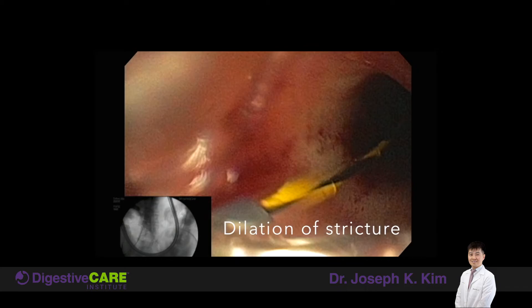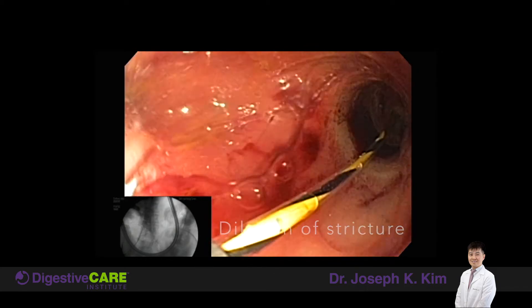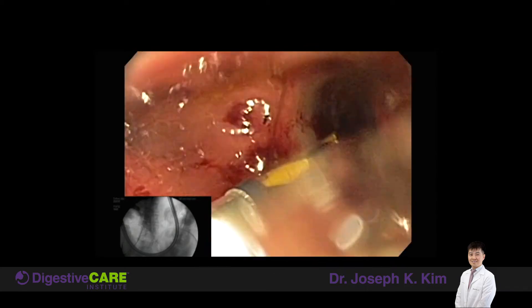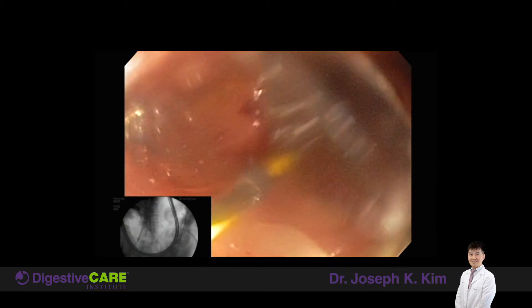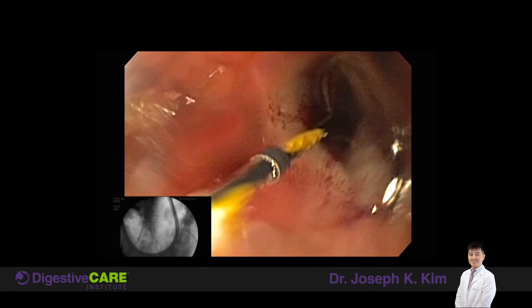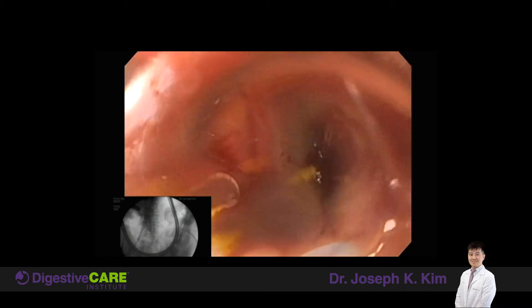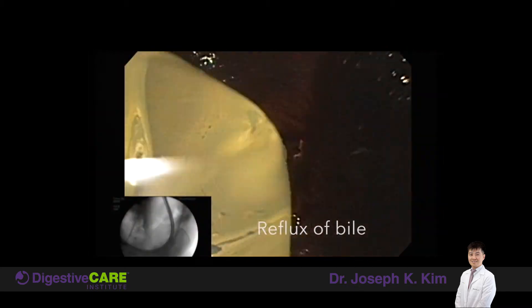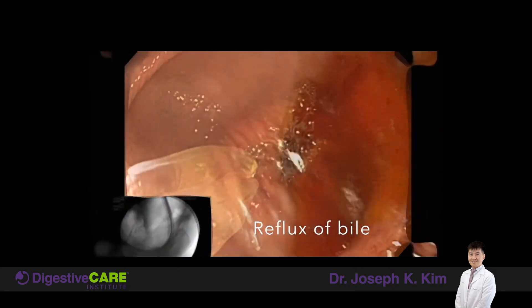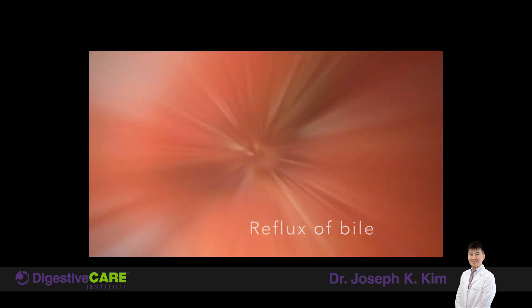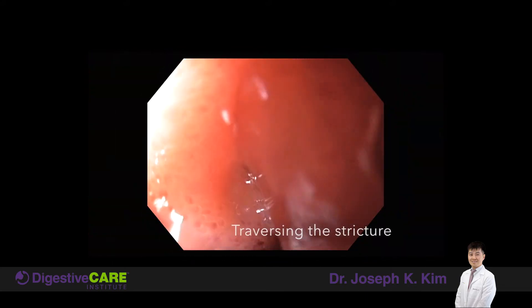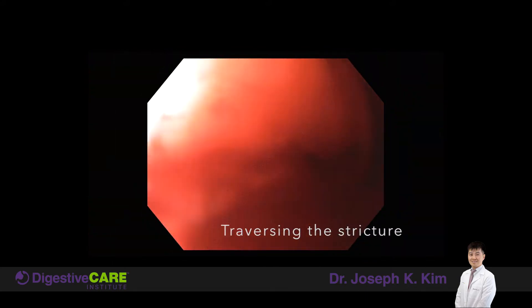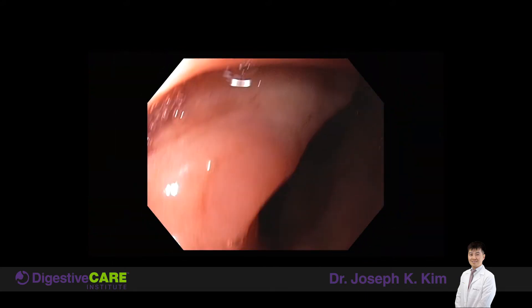Now we're filling up this balloon with saline to cause radial pressure to expand this area, stretching the tissue slowly. We need to do it step by step. And you can see once I dilated it, I'm able to go right across the stricture into the small intestine.